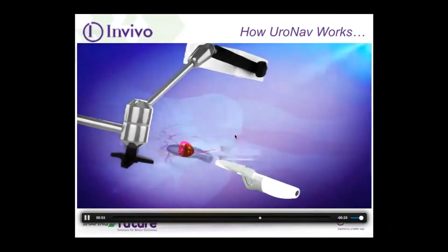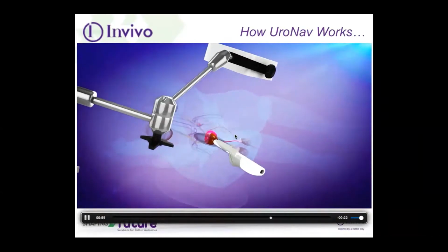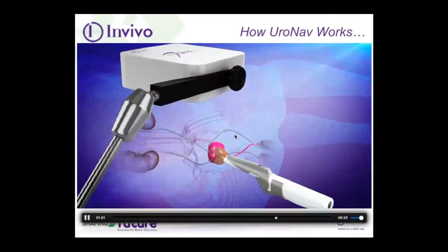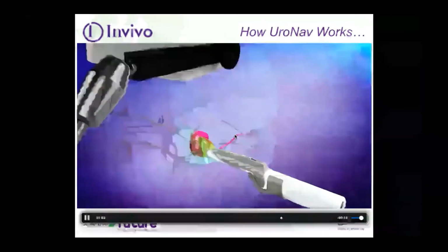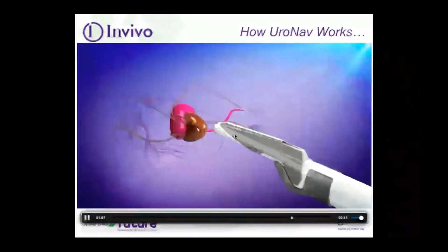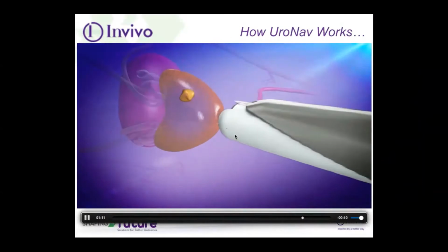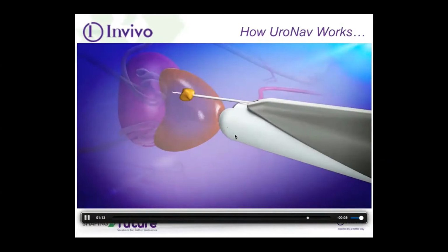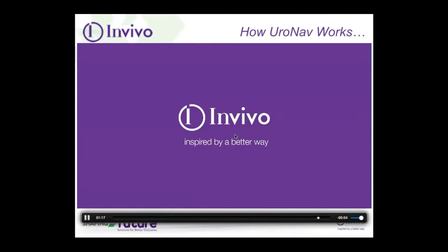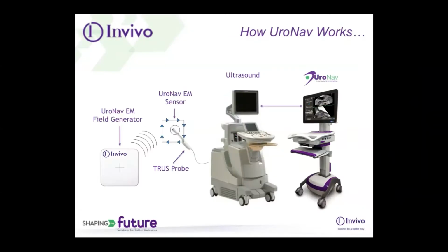And here's a short video showing how that's done. And so here's a standard transrectal biopsy. And the nice thing about this is that from a workflow standpoint, this is exactly how we do our regular biopsies. And it doesn't really add too much time to the regular workflow of how we as urologists do this biopsy in our clinic. And it's not much of a big footprint in our clinic.